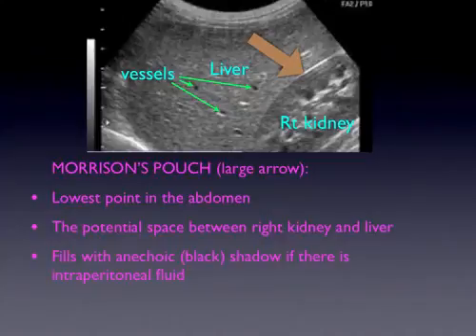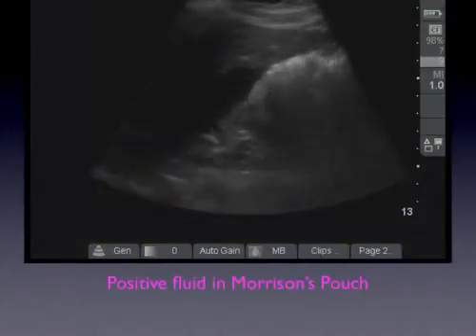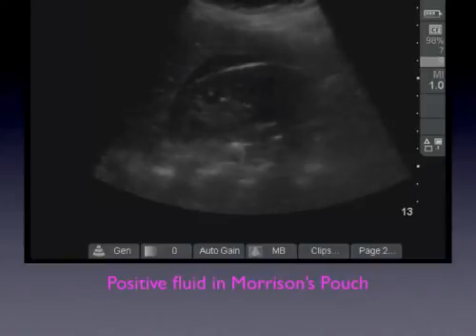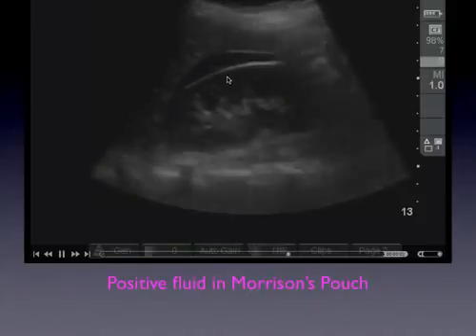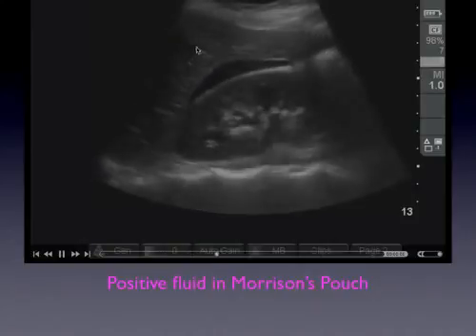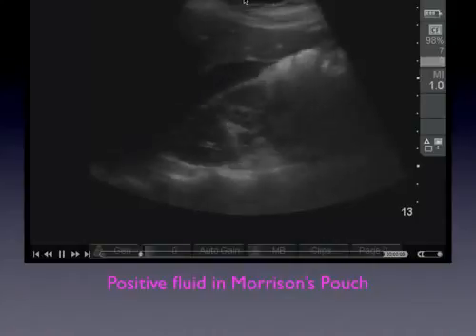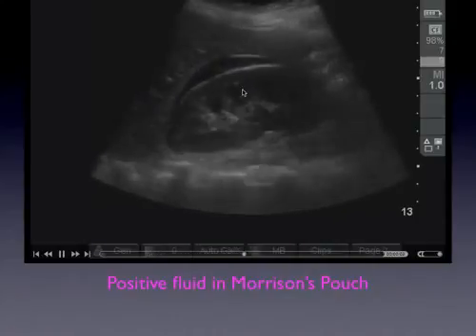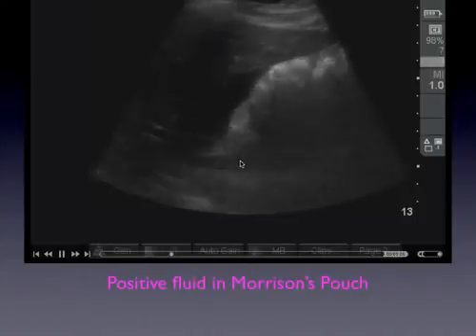If there's fluid, then it will appear anechoic or black. This scan does show positive fluid in Morrison's pouch, which we can see right over here. So this is a markedly positive scan, and again, this is kidney. You can see some of the pyramids in the kidney, and this is liver over here. The image is being taken with this probe up here, and the ultrasound beam is coming more posteriorly, which makes sense because the kidney is a more posterior structure as you move down.